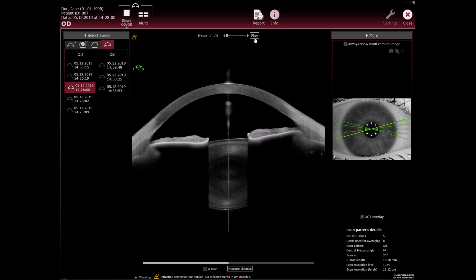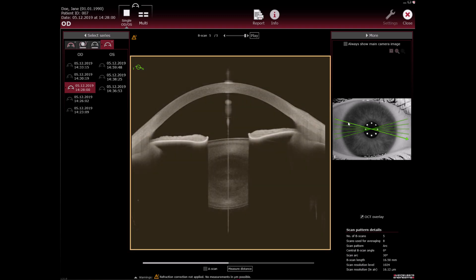All the scans made during the examination are shown as B scan lines on the camera image. When you click a B scan line on the camera image, the corresponding OCT section image is displayed.